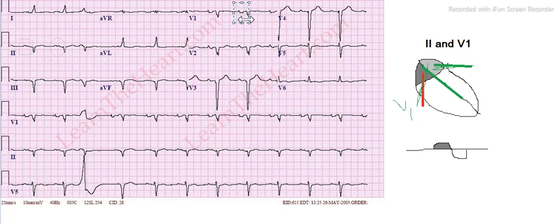By that, what I mean to say is that in V1, because of left atrial enlargement, this P wave morphology will be greater in magnitude. The representation of left atrial enlargement will be like this. This negative deflection will be greater than one small square box.